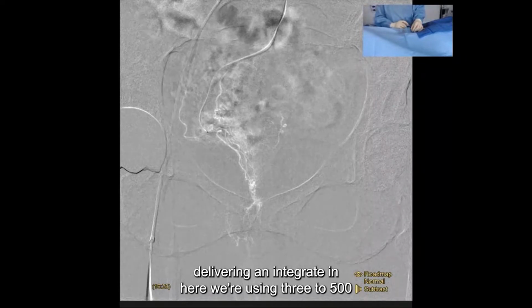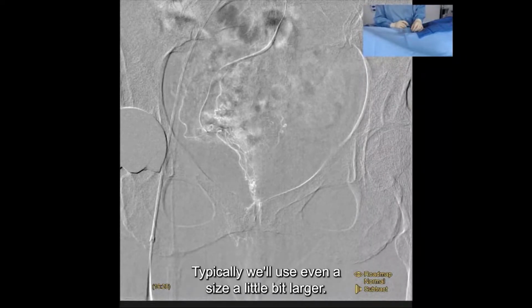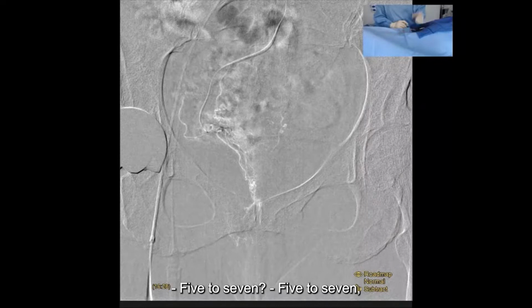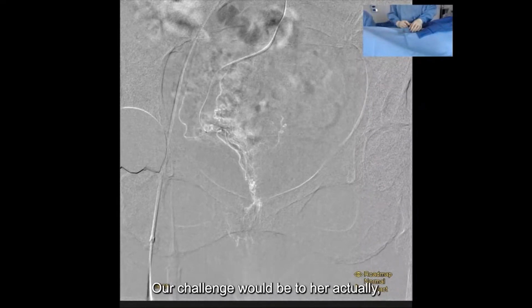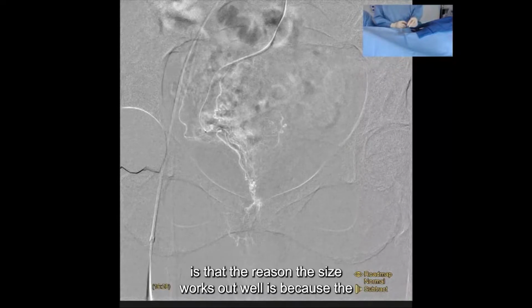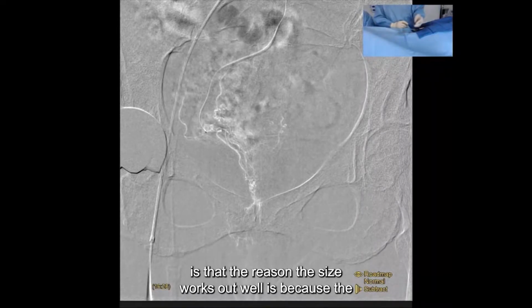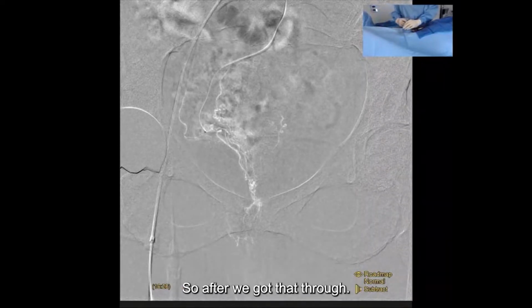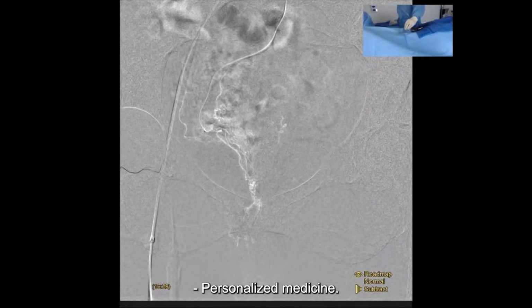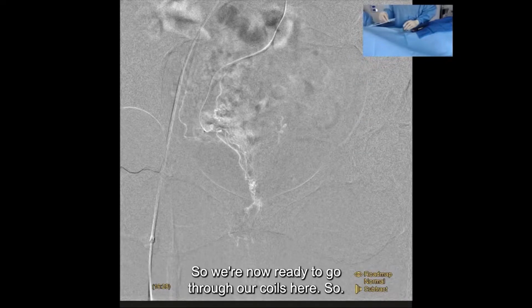In here, we're using 300 to 500 size. Typically, we'll use even a size a little bit larger. 500 to 700. 500 to 700. Somewhere around 600 seems to be an ideal size. Our challenge in her actually is that the reason the size works out well is because of the size of her smaller vessels. So it's really not one size fits all. Personalized medicine. So after we've got that through, there you go. All right.